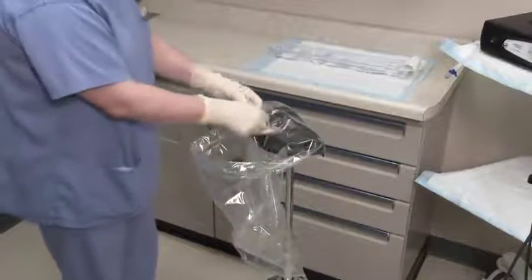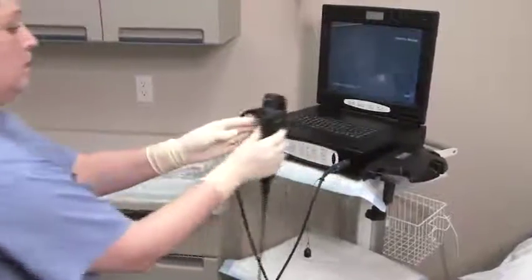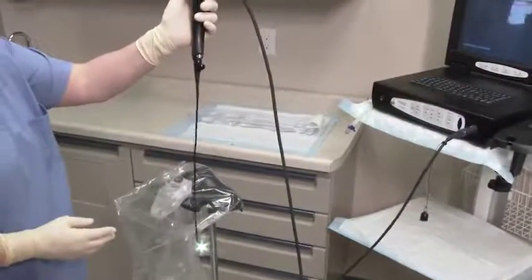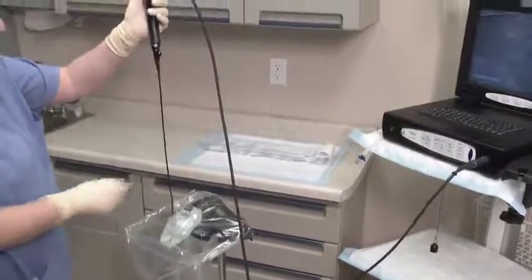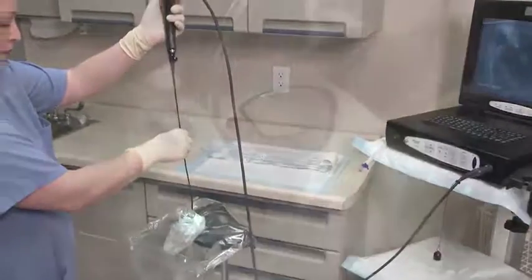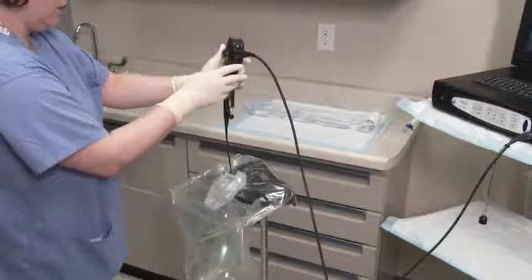Fold back the control body cover to expose the top opening of the Endosheath connector. Before inserting the cystoscope into the sheath, it is important that the articulating distal end of the scope is straight or in the neutral position. While standing directly in front of the installation stand, hold the cystoscope vertically over the sheath connector. Align the scope's D-shaped insertion tube with the D-shaped opening of the sheath connector. The flat side of the scope must be matched up with the accessory port and tubing.